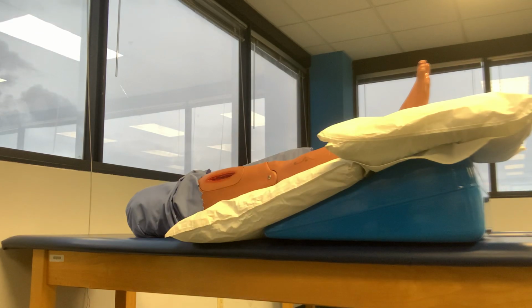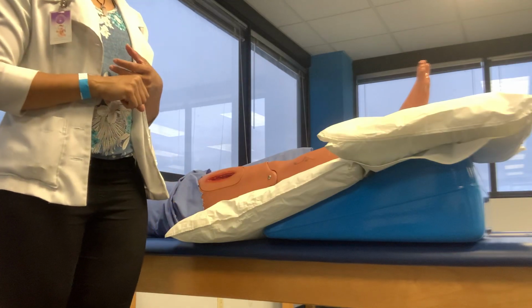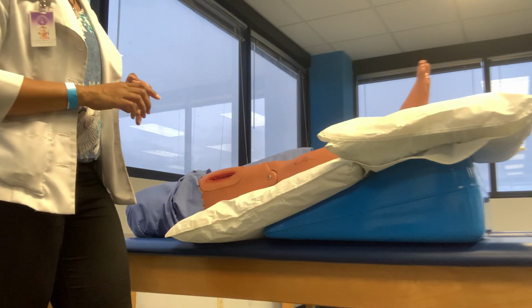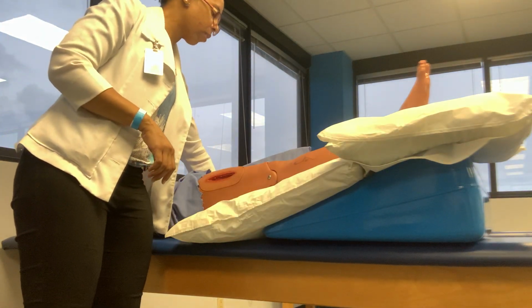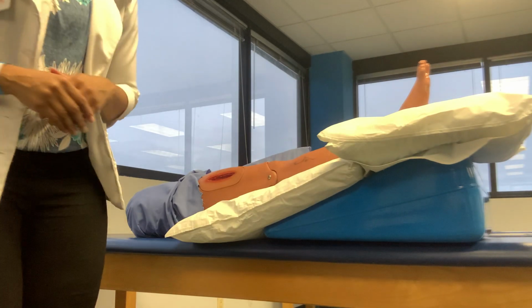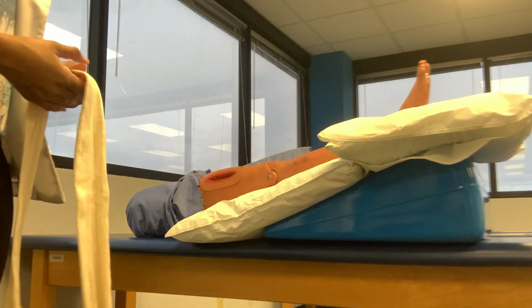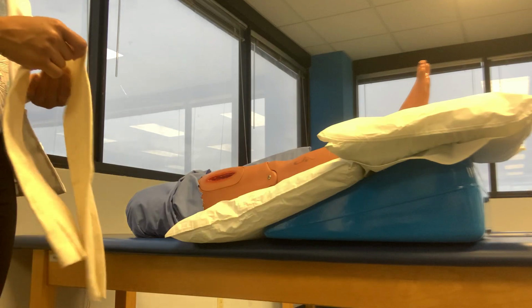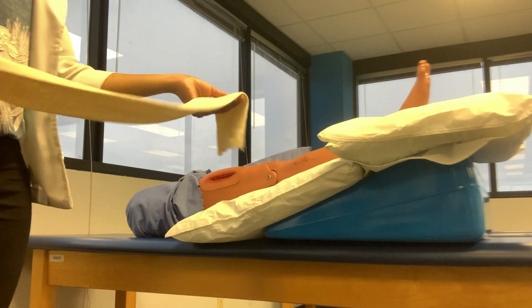So once I've completed my skin check, I've done my sensation test, and I've done my girth measurements. Oh, I forgot to leave my call bell, so I'm going to leave the call bell on the side here for the patient. Then I'm going to apply the stockinette. So you can have an area where you can have a chair or a stool where your equipment is going to be set up that you're able to move back and forth to gather your supplies. So then I'm going to apply the stockinette.